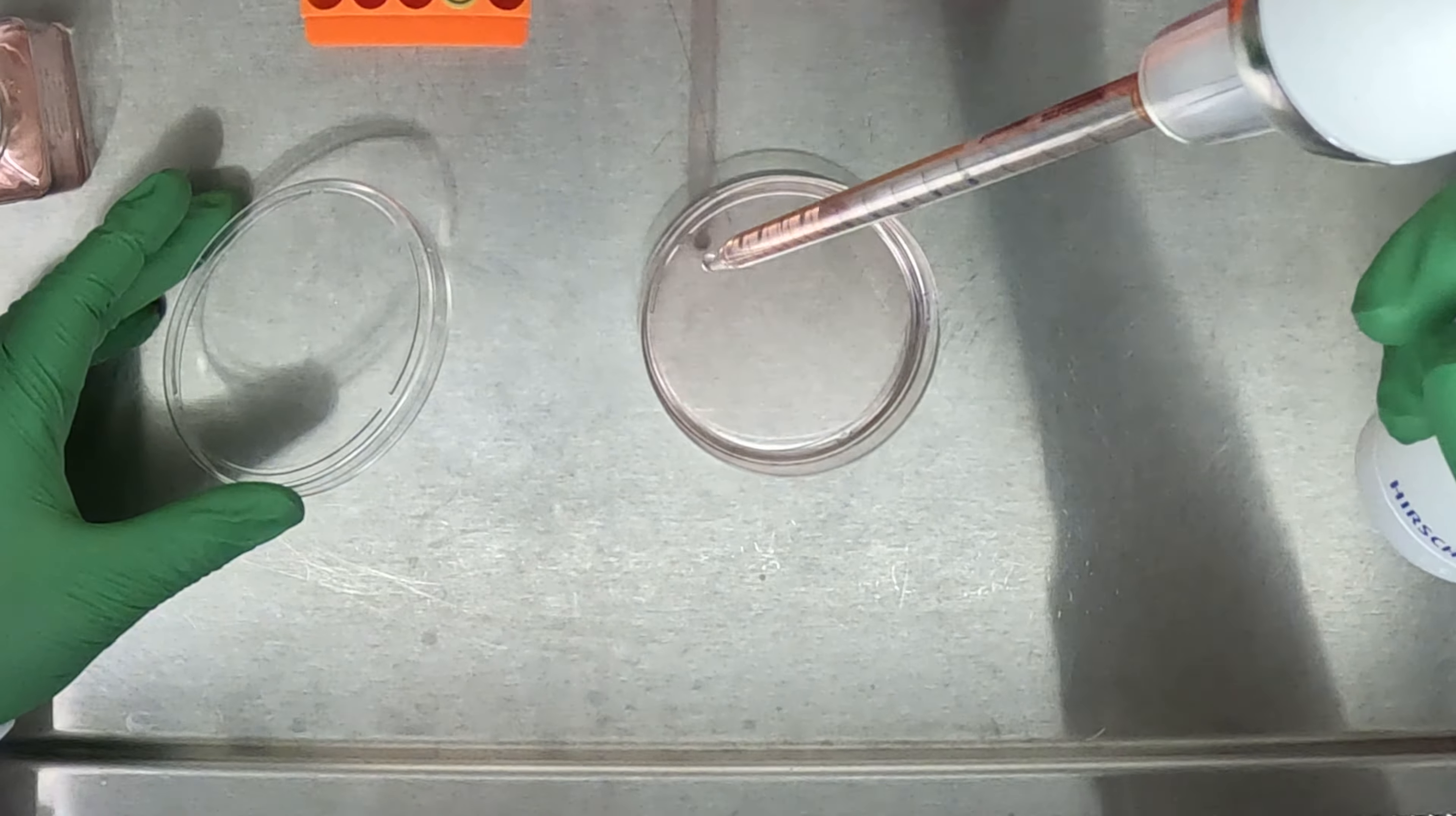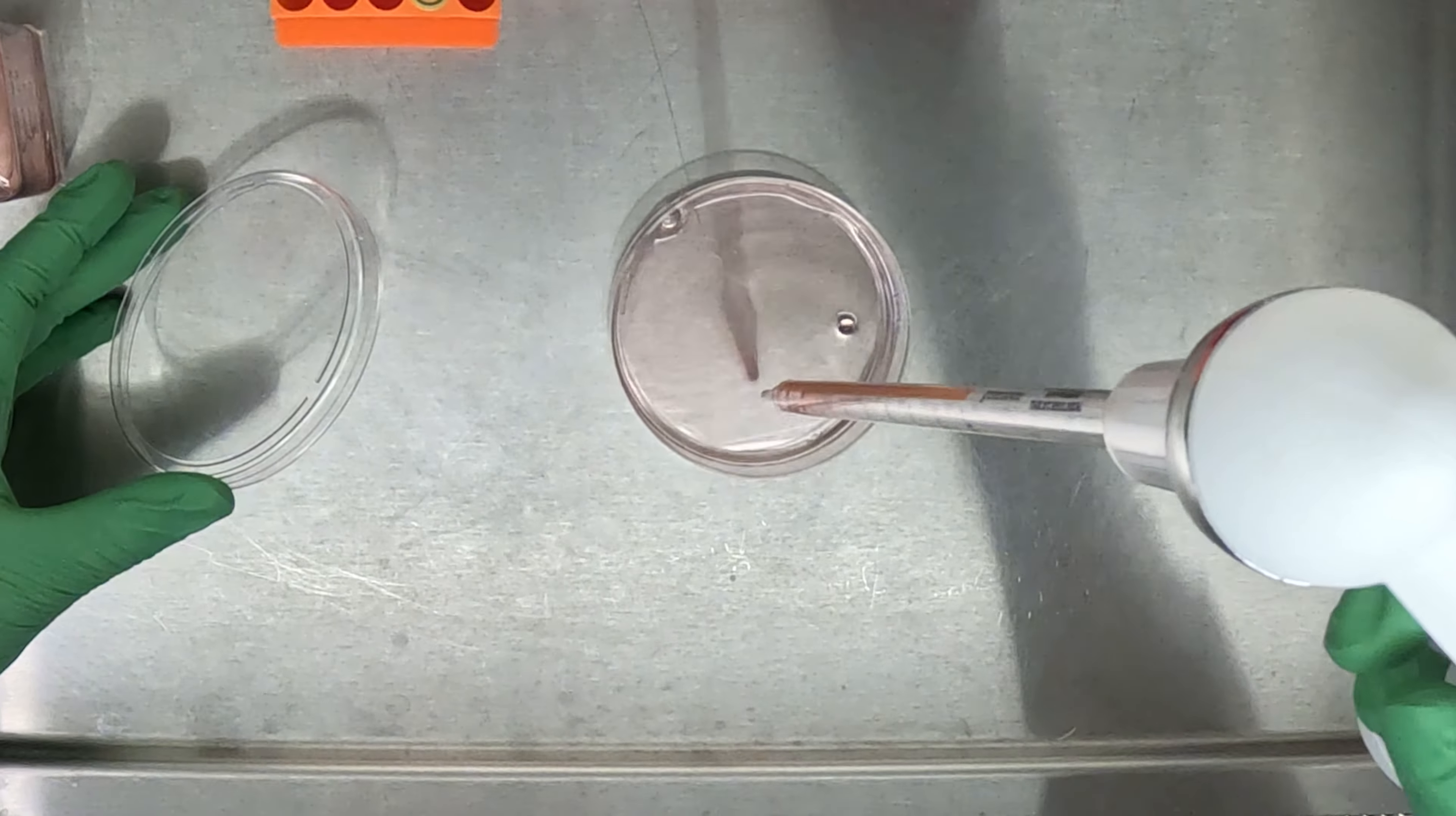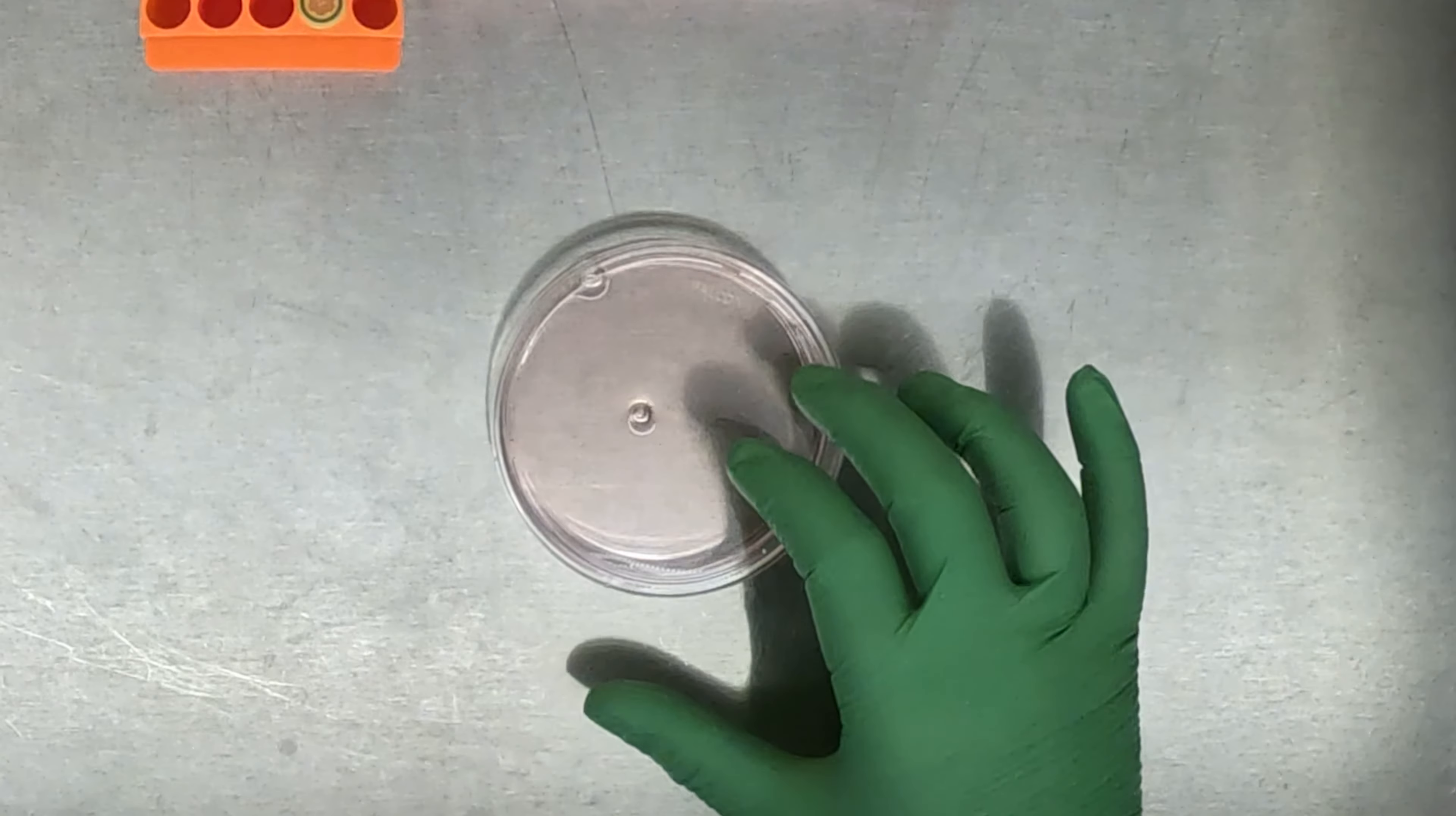At this step, it's very important to make sure that you are evenly distributing the 5ml across the entire 10cm dish. This is to ensure that the cells are equally distributed across the plate. Once you have aliquoted the entire volume of your cell suspension to your recovery dish, gently move the plate back and forth and side to side three times to make sure that the cells are evenly distributed.